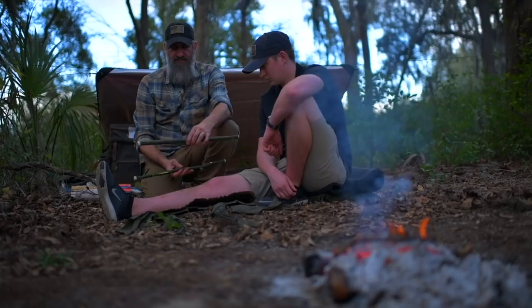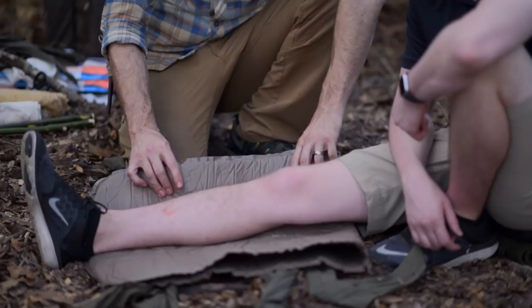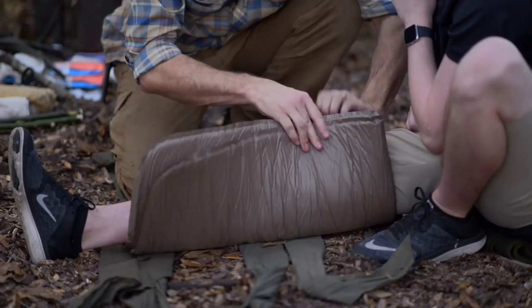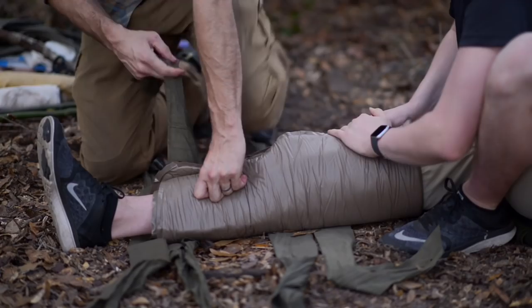If I want to do just the brace, which is what I want to do in this case, I'm going to wrap this up — and keep in mind this is deflated right now. I'm going to bring this up around his knee and loosely tie it to hold it in place where I want it.